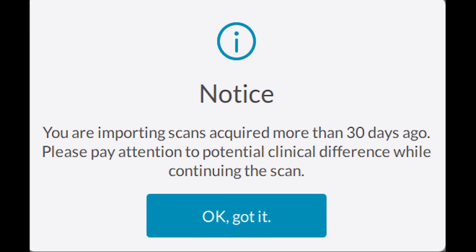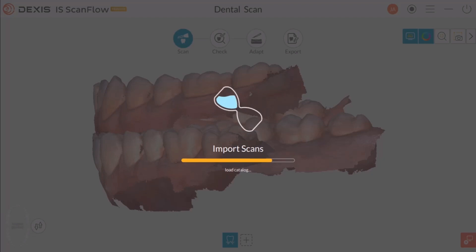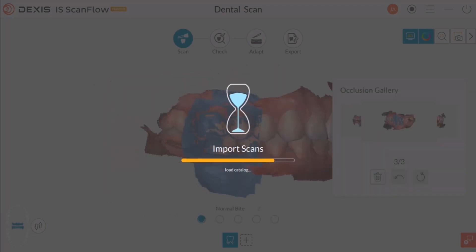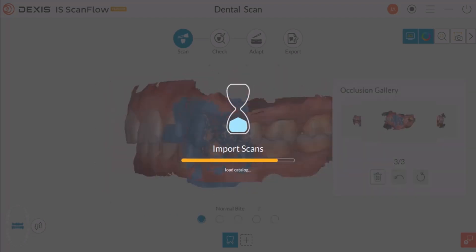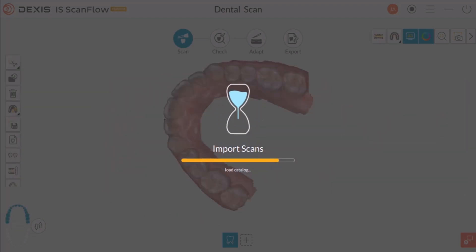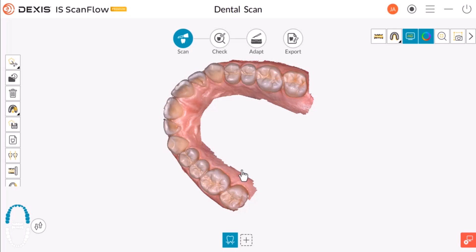If the window Notice — scans acquired more than 30 days — pops up, select OK, got it. The imported scan is then displayed in the software.